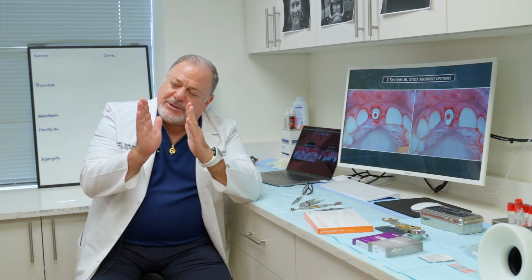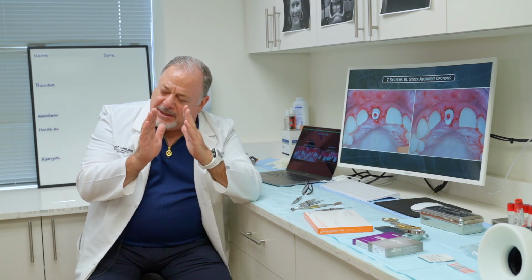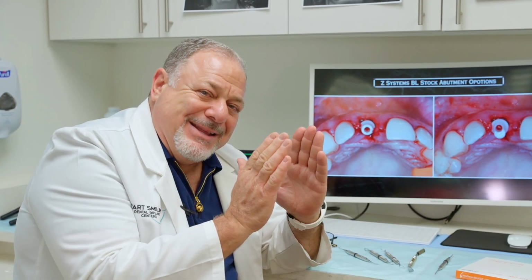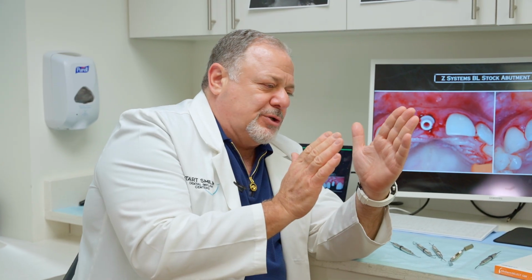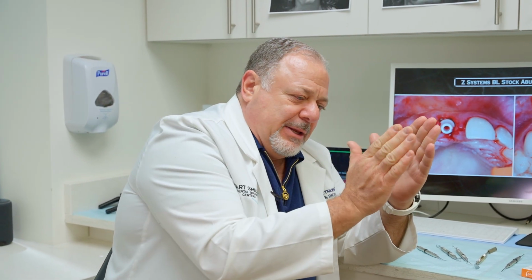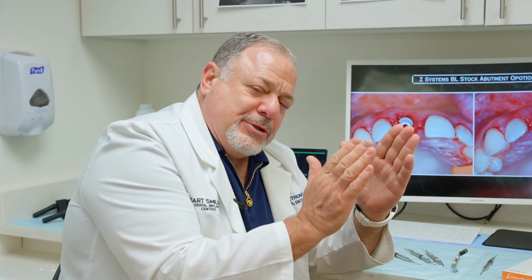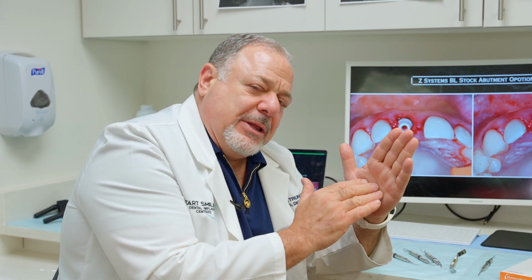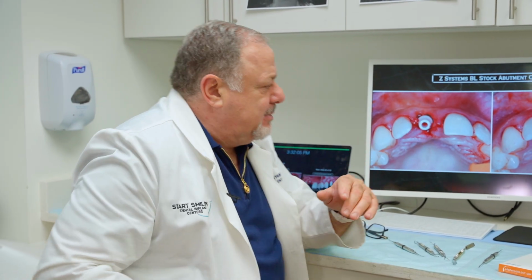If you place a titanium implant 10 years before at a level and you end up losing a tooth next to it, and you go and place another titanium implant and you place it too deep or too shallow, you're going to pull bone from the pre-existing implant and cause some sort of a peri-implant defect, okay? The zirconia, it's not critical. You can have an implant you placed 10 years ago, you can have a tooth, and you put a zirconia implant in, and if you go deeper or more shallow with your positioning of the implant itself, it's not critical like it was with titanium. That's another huge benefit of zirconia implants themselves.